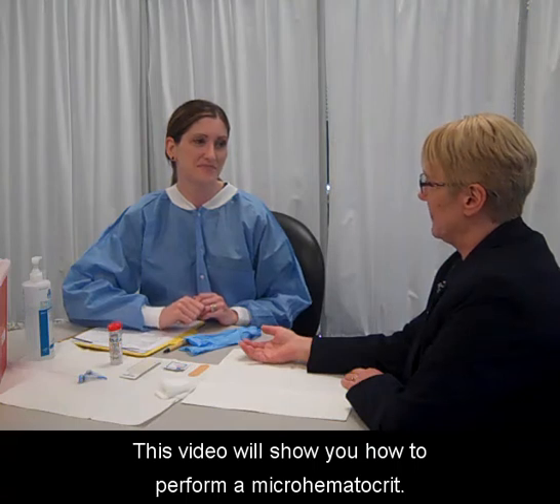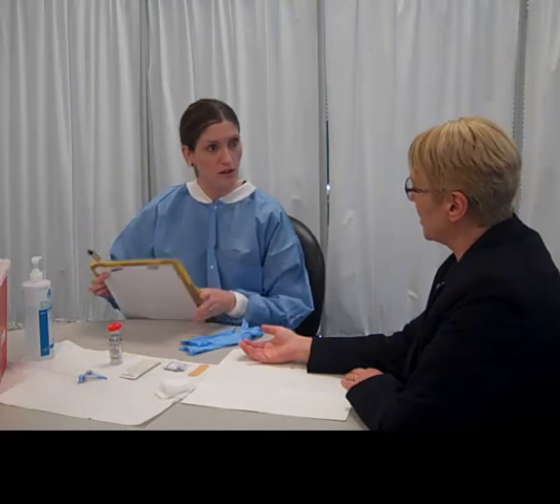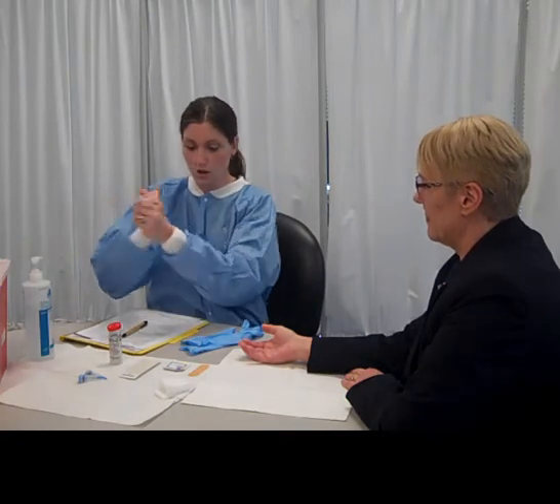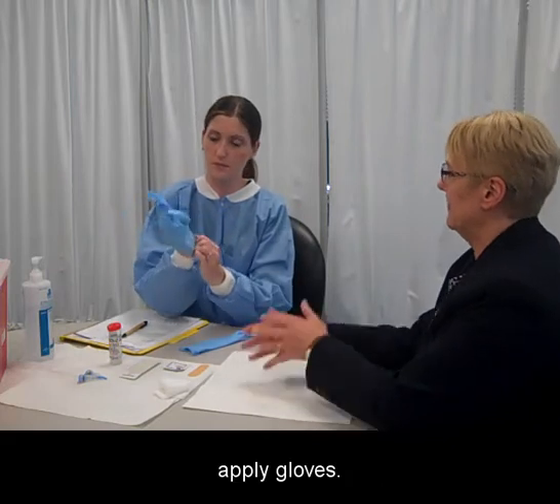This video will show you how to perform a micro hematocrit. Introduce yourself, identify your patient, wash your hands, and apply gloves.